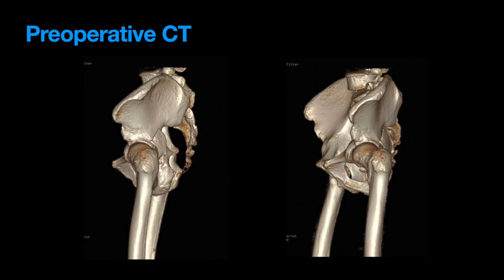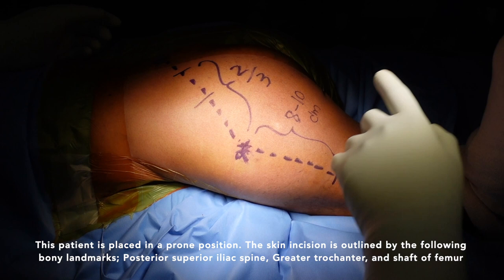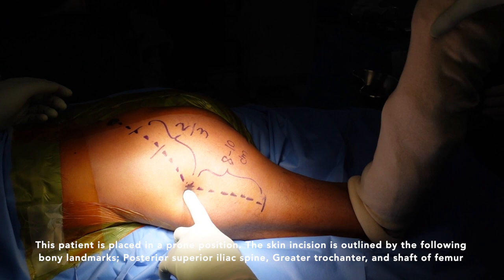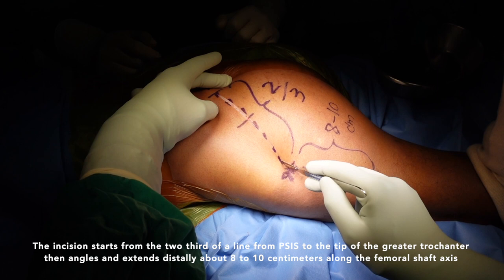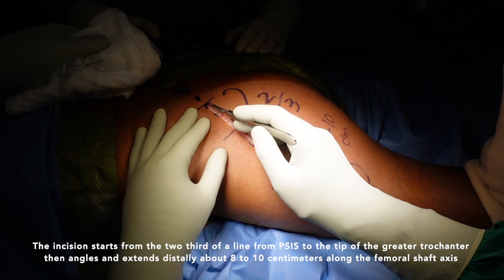This patient is placed in a prone position. The skin incision is outlined by the following bony landmarks: posterior superior iliac spine, greater trochanter, and shaft of femur. The incision starts from the 2/3 of a line from PSIS to the tip of the greater trochanter, then angles and extends distally about 8 to 10 centimeters along the femoral shaft axis.